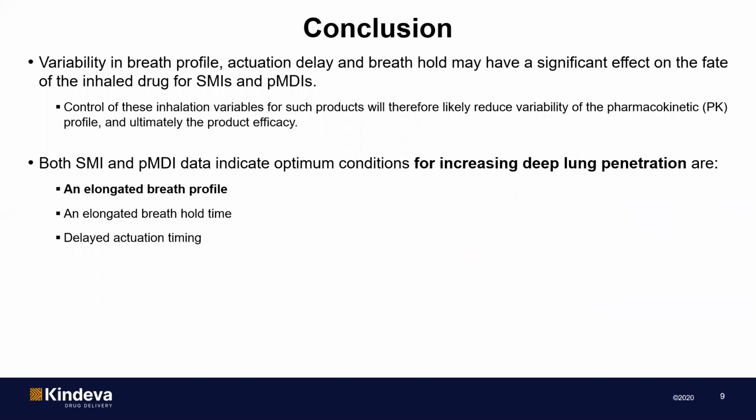So in conclusion, variability in these inhalation profile factors may have a significant effect on the fate of the inhaled drug for both SMIs and MDIs. And from the analysis done, we can give indications in terms of the optimum conditions for deep lung penetration.